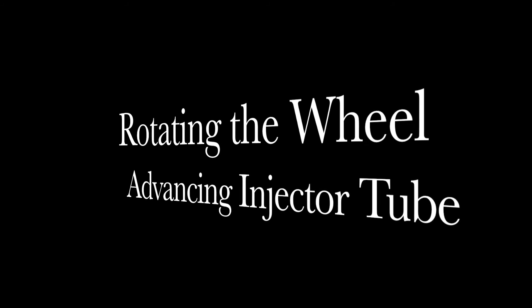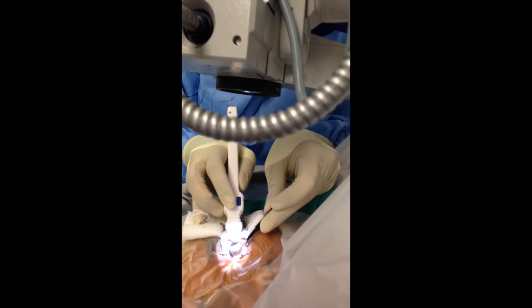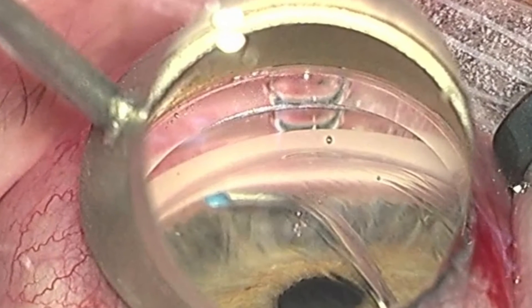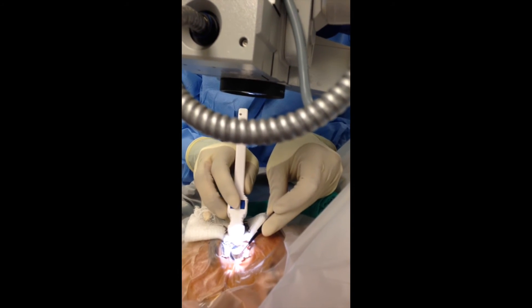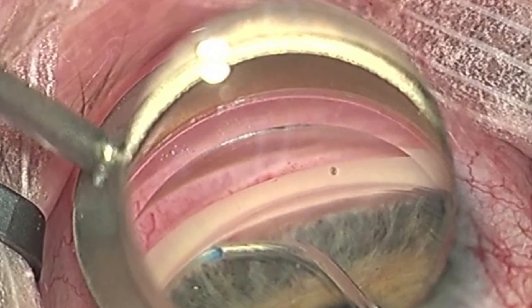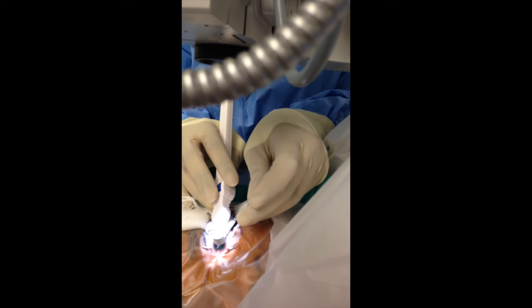Next I will show how I rotate the wheel and advance the injector tube and retract it. With the tip in proper placement, the wheel is dialed in one direction, thus advancing the tube into Schlemm's canal, and then the dial is retracted in order to allow viscoelastic to be placed into Schlemm's canal to dilate it, as well as the outflow channels.